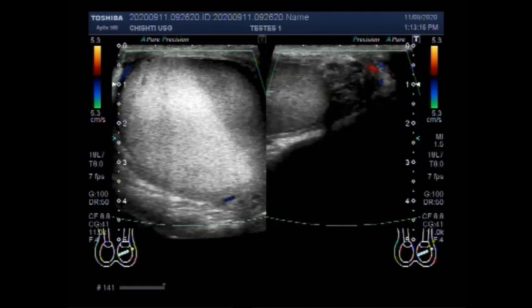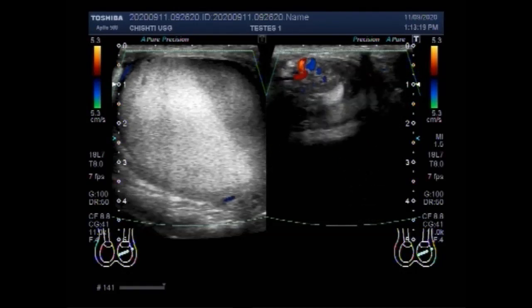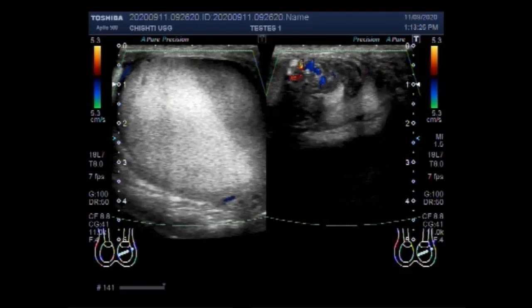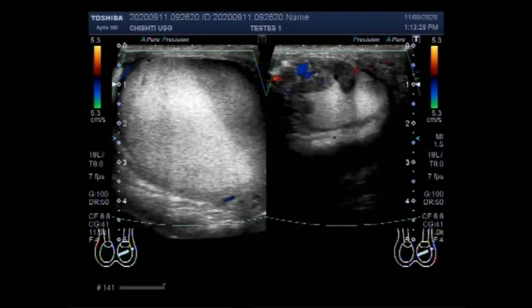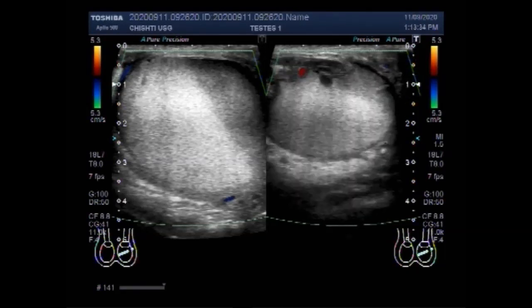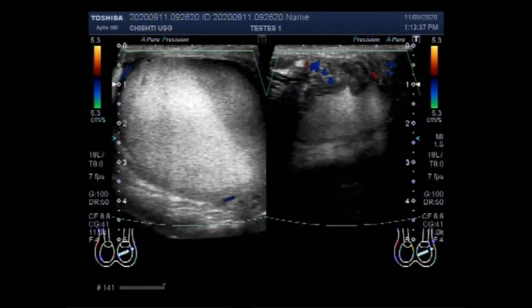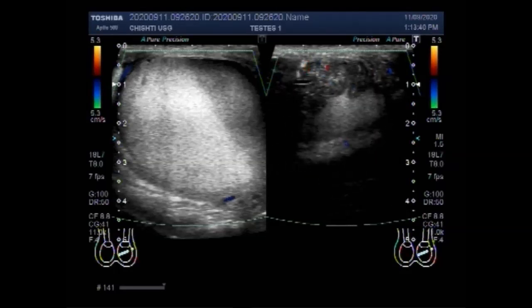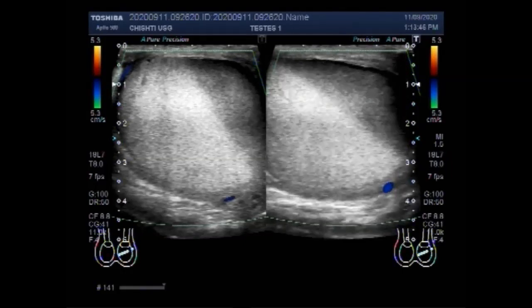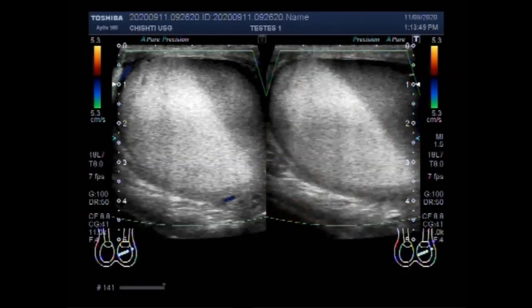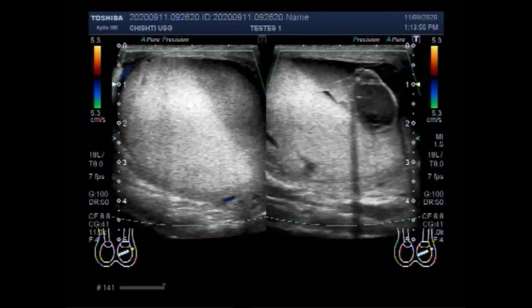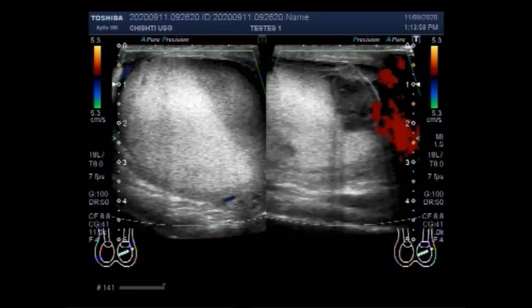Transverse scrotal imaging to depict both testes is extremely important, allowing comparison of grayscale and color Doppler appearances. The asymptomatic side should be scanned first to set grayscale and color Doppler gains for optimal comparison with the affected side. Color Doppler and pulsed Doppler ultrasonography should be optimized to depict low-level velocities and blood flow in the testes and surrounding scrotal structures.